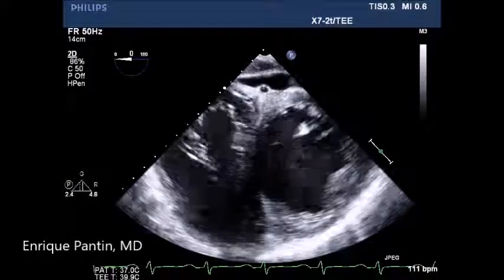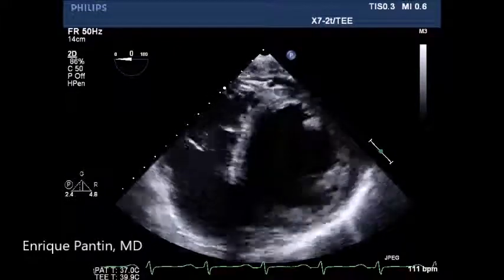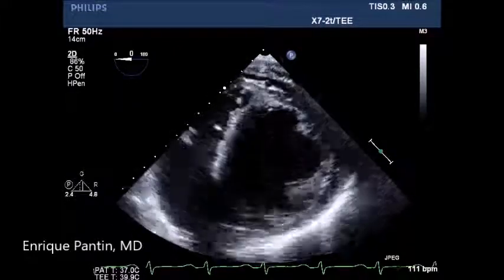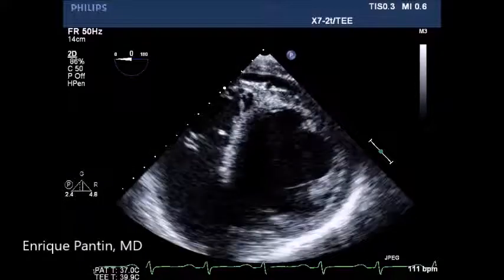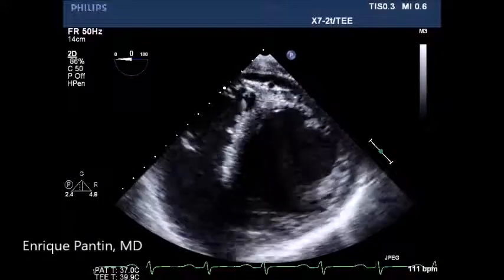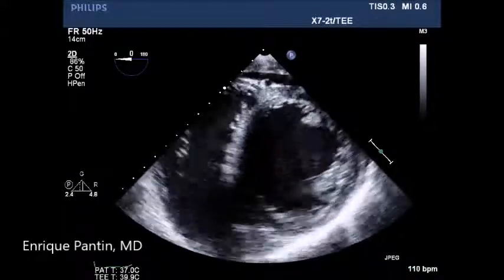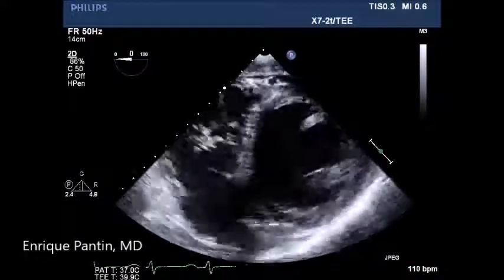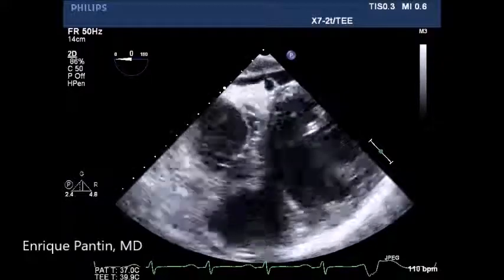The echo probe will continue to be advancing to the stomach and the middle cardiac vein can be noted in the image. Note the severe biventricular dysfunction of this patient.